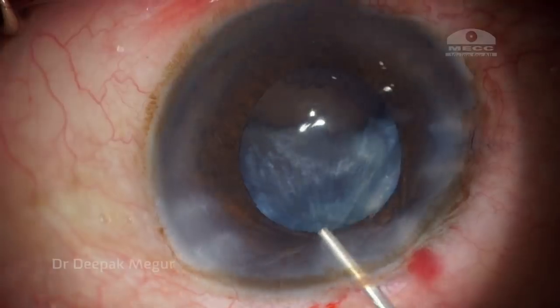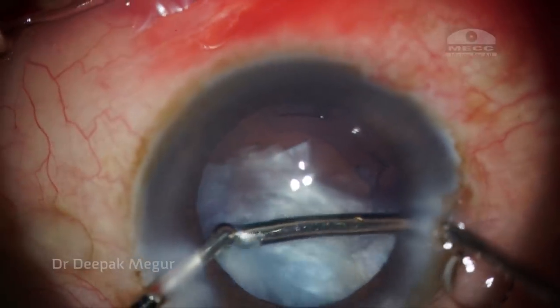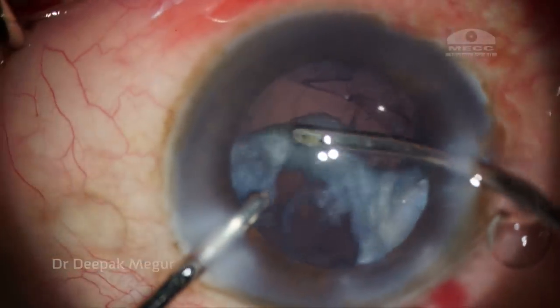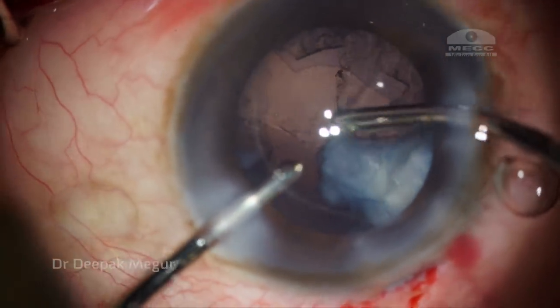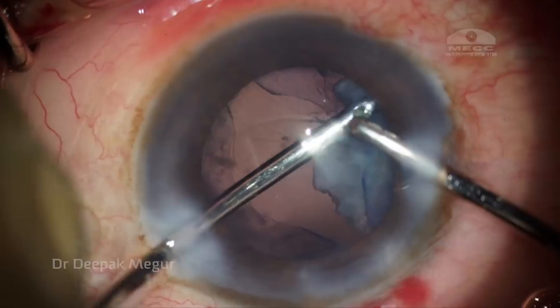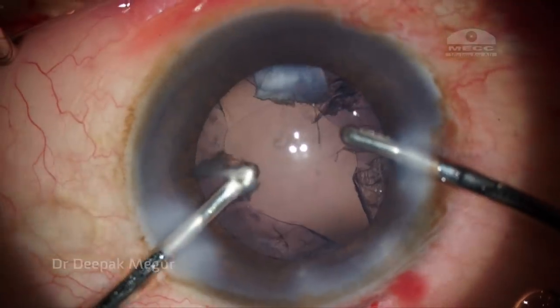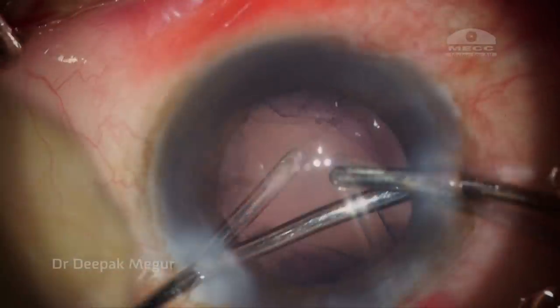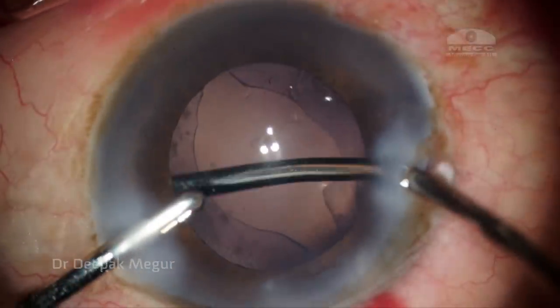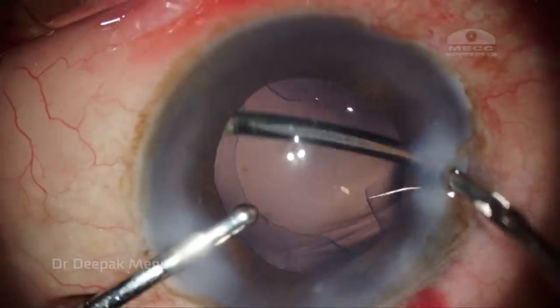So we are left with a chunk of epinucleus. And I'm again forming the bag and the anterior chamber with the OVD and then trying to aspirate out the epinucleus with my bimanual irrigation aspiration handpiece. The last chunk of the epinucleus and some of the cortex is removed without any problem. So the nucleus management and cortical aspiration was quite uneventful and the job is done. We are just left with implanting the intraocular lens in the bag.